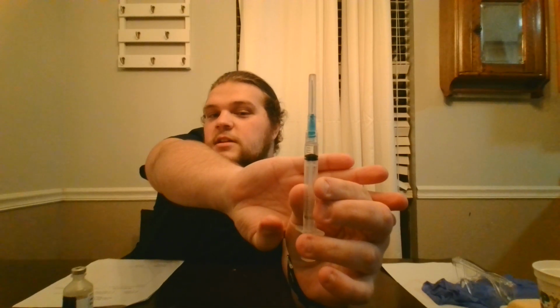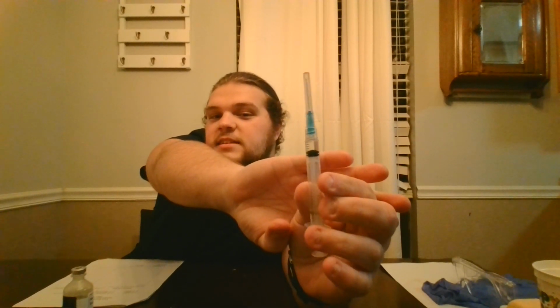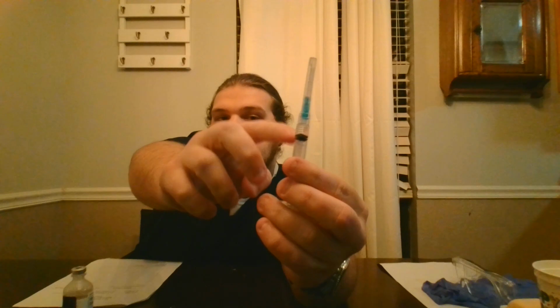All right, I'm going to then scoop up my cap of my blunt cannula, unscrewing it, and now I am going to apply my needle cap. So again, now verifying my dose, so 5 milligrams, vial states 10 milligrams per milliliter, so half a milliliter. This is half a milliliter. All right. You can check. The numbers are a little worn off. I apologize. I was practicing a lot. That's the half milliliter mark, and this is where the 1 mark would be.